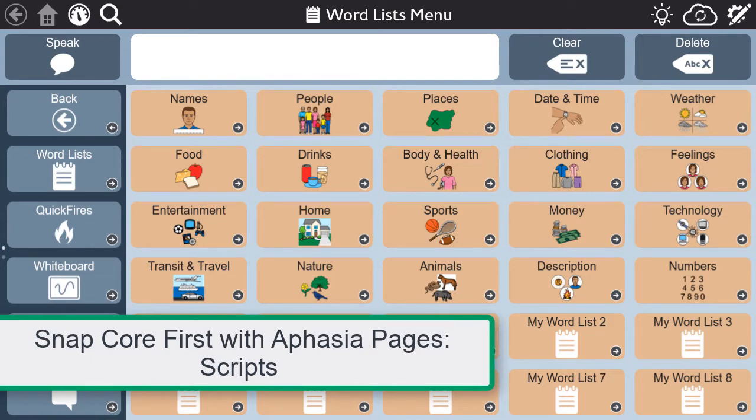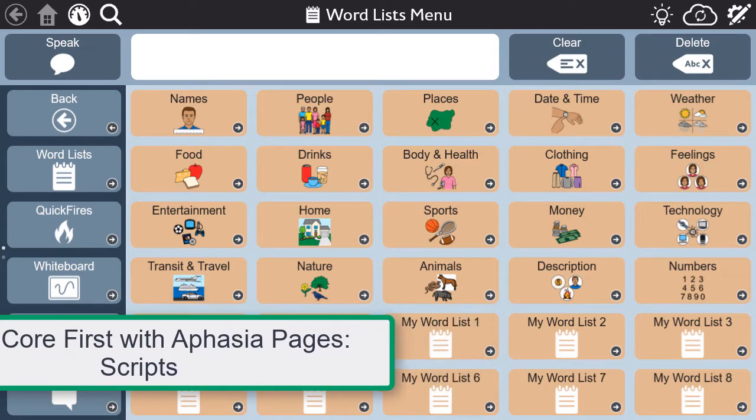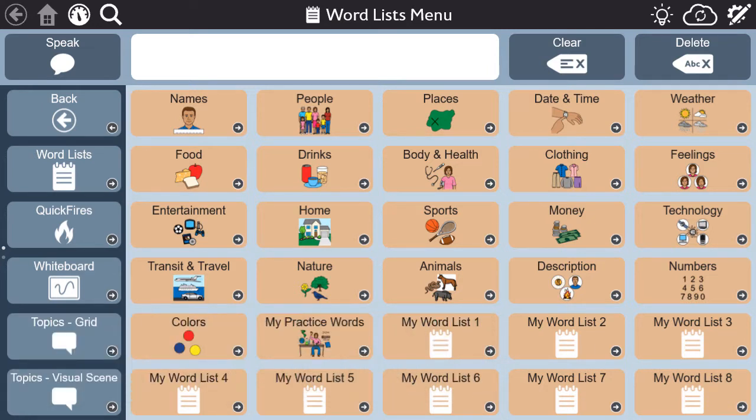Many people don't consider AAC as a support for practicing natural speech, but the aphasia pages in Snapcore First provide tools to be able to do so — tools like scripts.